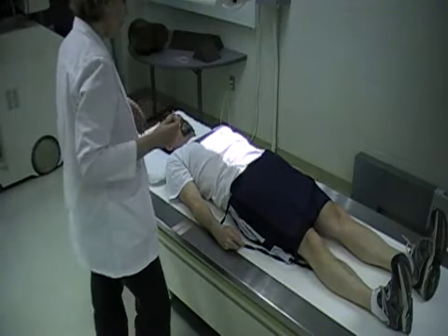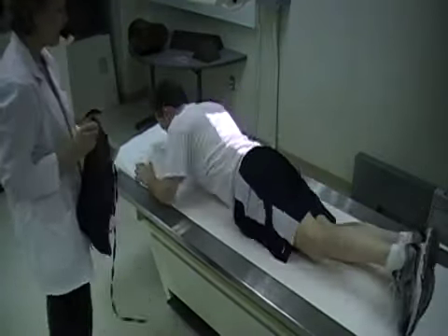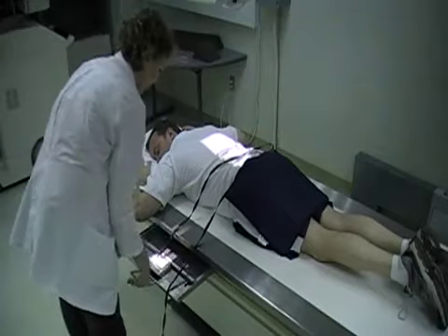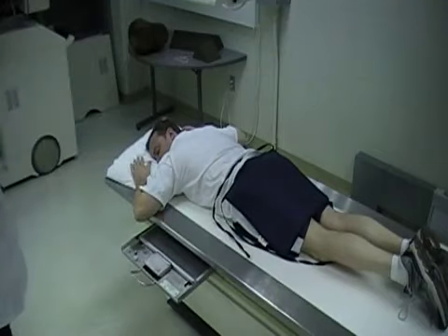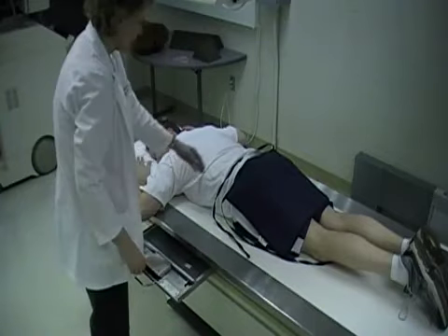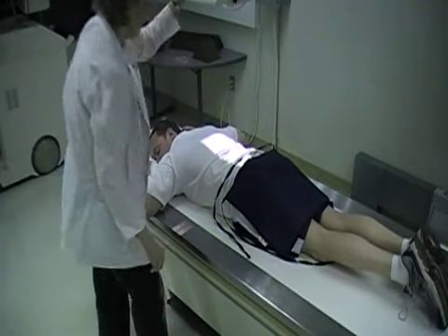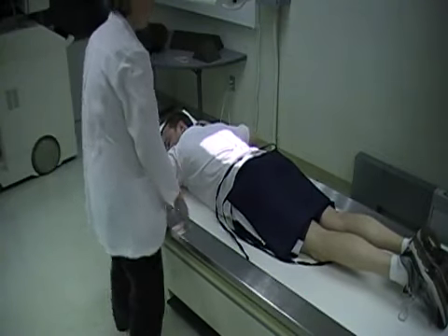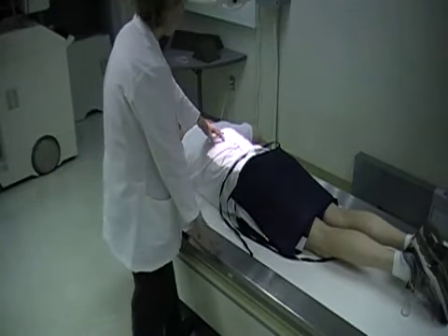Okay, now I'm going to have David roll over to his stomach. We're going to do a PA projection. Since he is PA, this is now the left side, so we need to mark the image receptor correctly. If I put the left marker here, this will indicate this is the left side of his body. Now make sure your patient is straight on the table, so I'm going to scoot his shoulders over, and then check for the mid-sagittal.